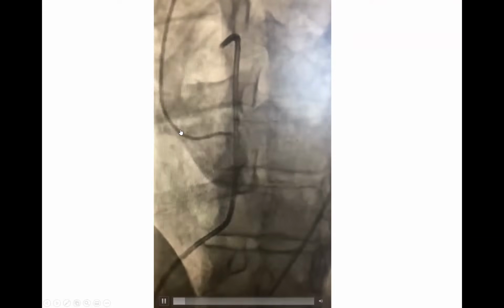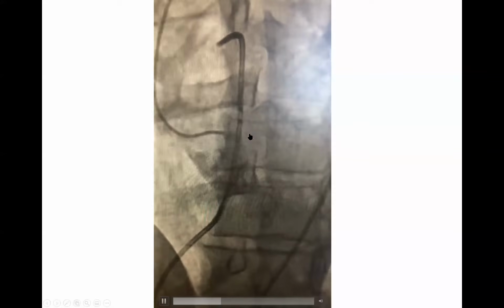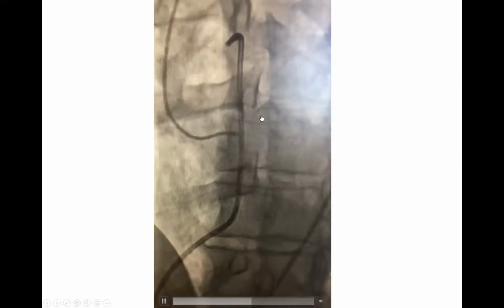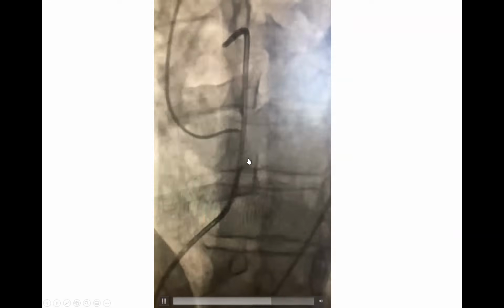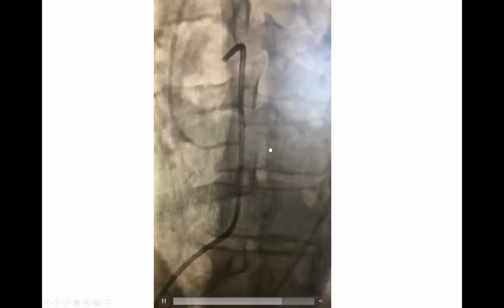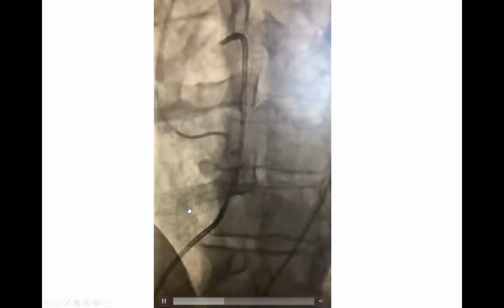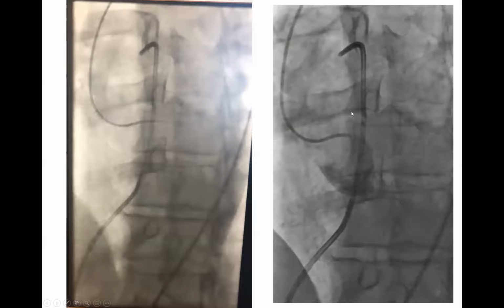A reminder, this is the catheter that has that big butt with a duck shape. So I'm using an Amplatz left, I couldn't cross. It's always important at this point to do an aortic root shot, not much contrast, 10 cc's, just to get an idea of the anatomy. So now I know the anatomy and I know the angle and I know where to aim to. So I put this as my guiding image as a reference, and now I start maneuvering with the wire using this as my guide.